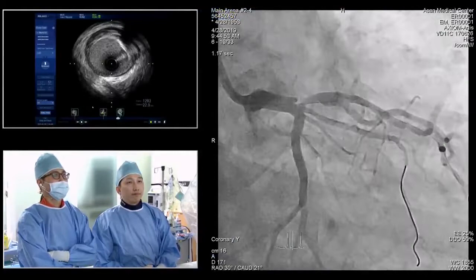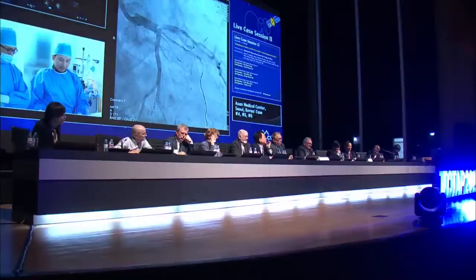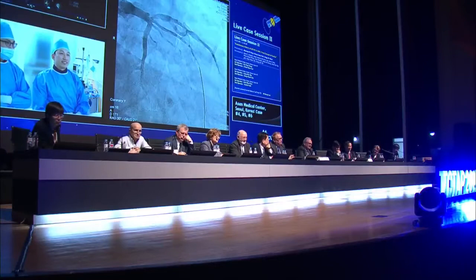I think, one, we have no data. Two, to remove enough plaque, there's a huge amount of plaque here. Now, yes, in Japan, they will spend 3 hours and keep doing iterative DCA with IVUS. But I think a stent here, given the size of the vessels, you're going to have a restenosis rate of probably 2% or less.